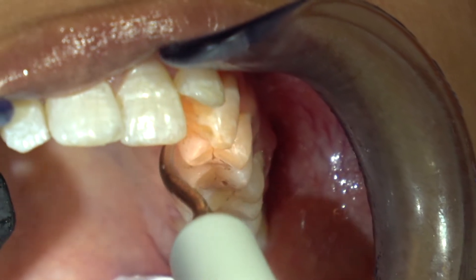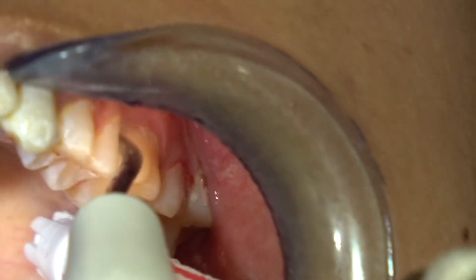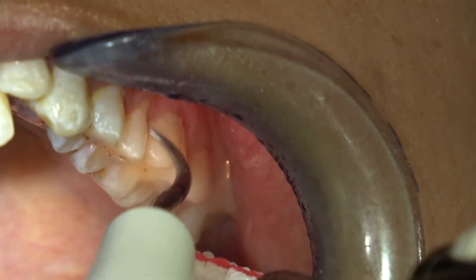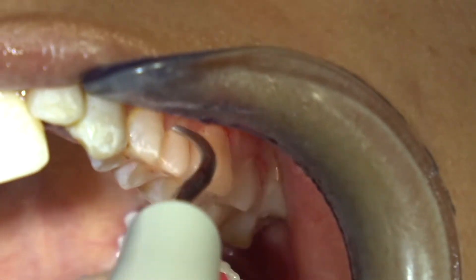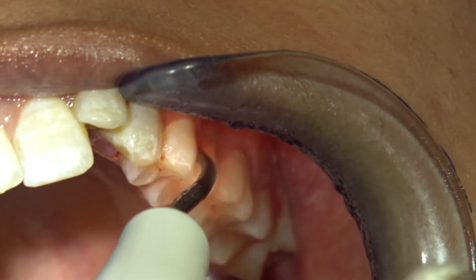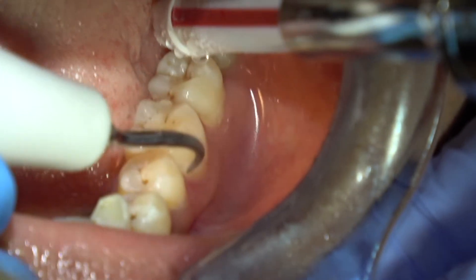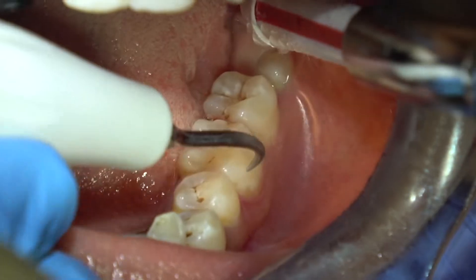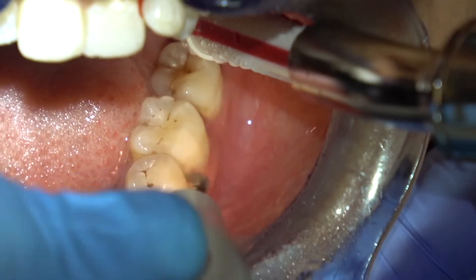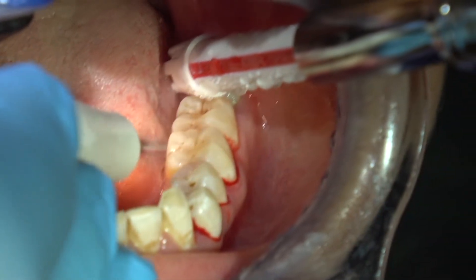I don't see how you could do this without administering local anesthesia, especially if the patient has some gingival recession on the facial, because that tooth is probably going to be hypersensitive. By anesthetizing the teeth and gingival tissue, you eliminate the hypersensitivity in a tooth that has gingival recession.